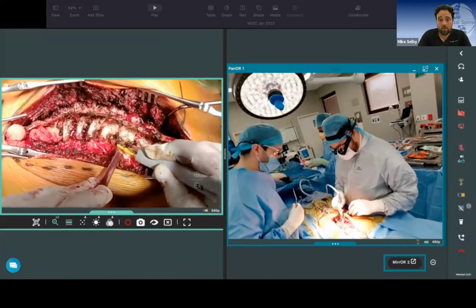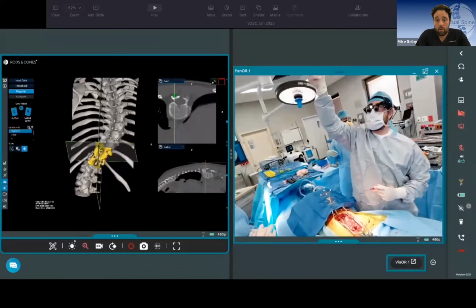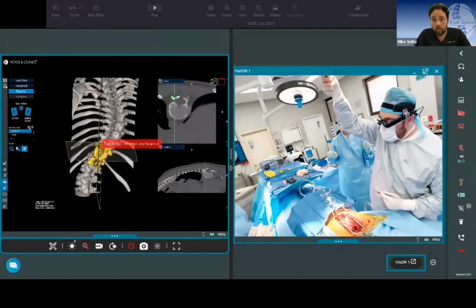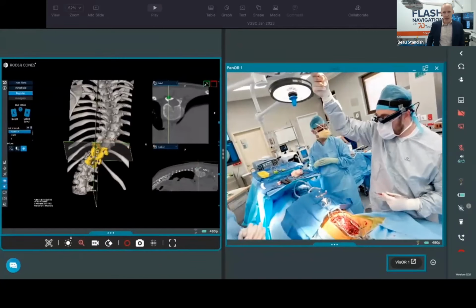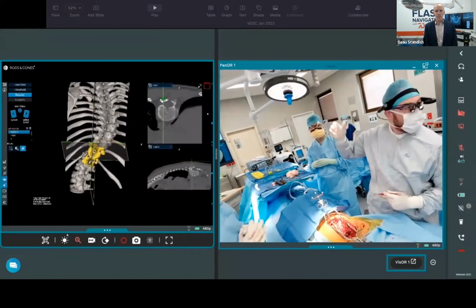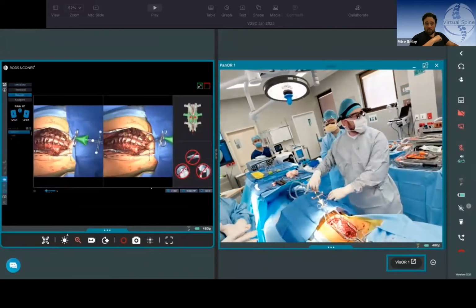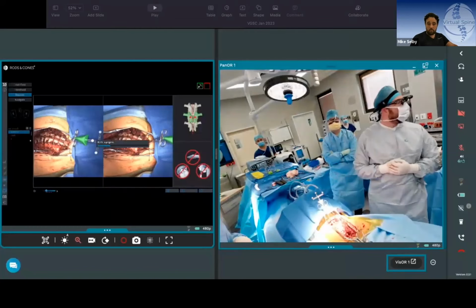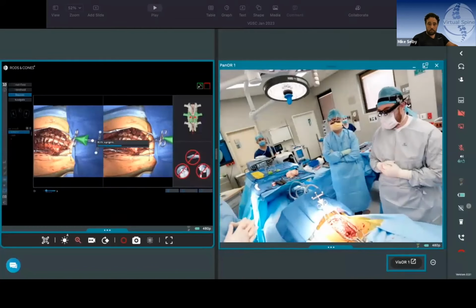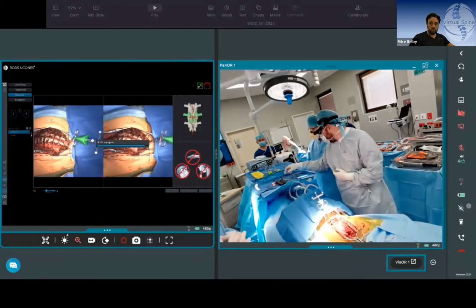And the setup there. And so this is where we come to the registration. You've got to rotate the light to match the spine. Beau, can you guys hear me on the video? Yes, we can. Let's have a look. The light's up there, and we're flashing now. We've got everything open. We've got our clamp on the spinous process. When it flashes, try and get your headlight out of it.